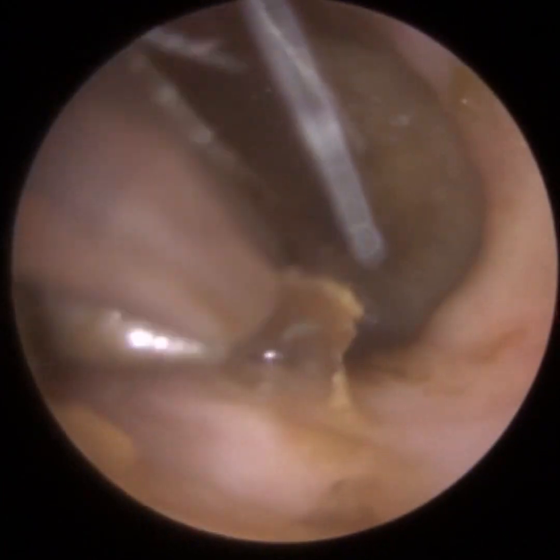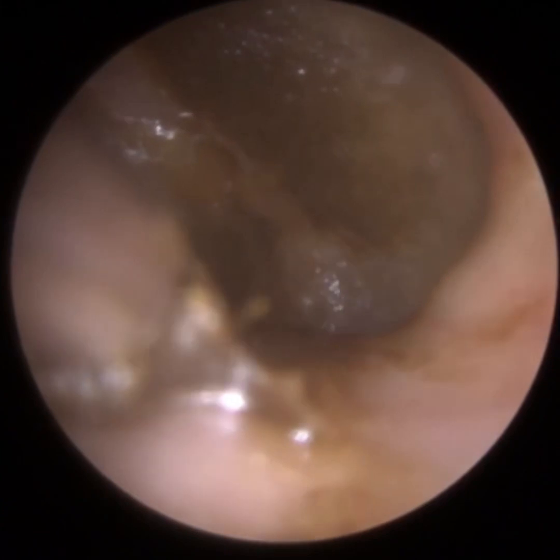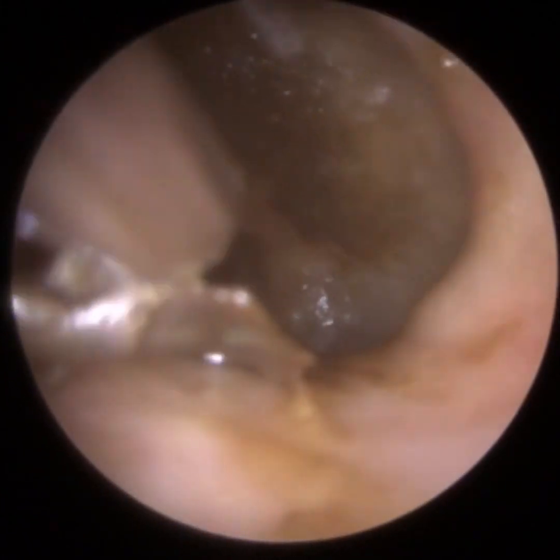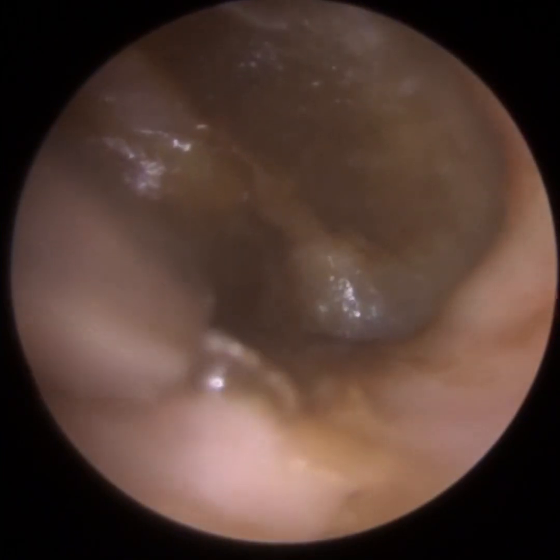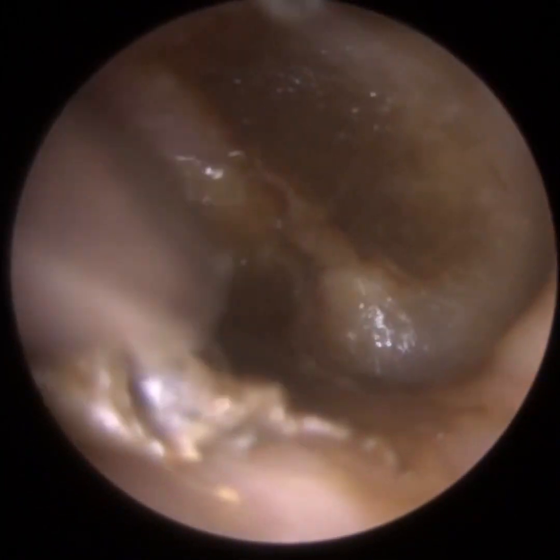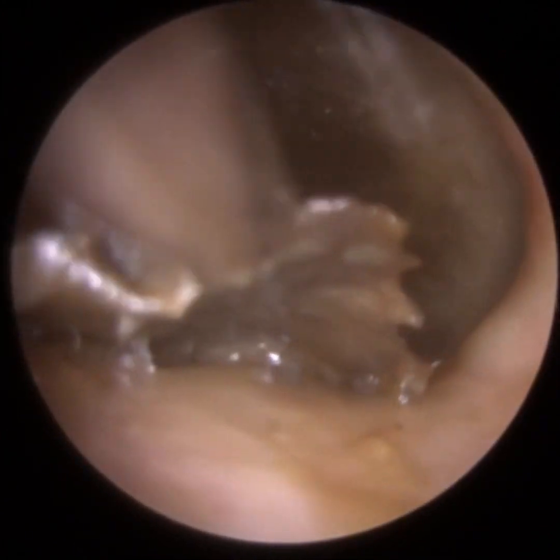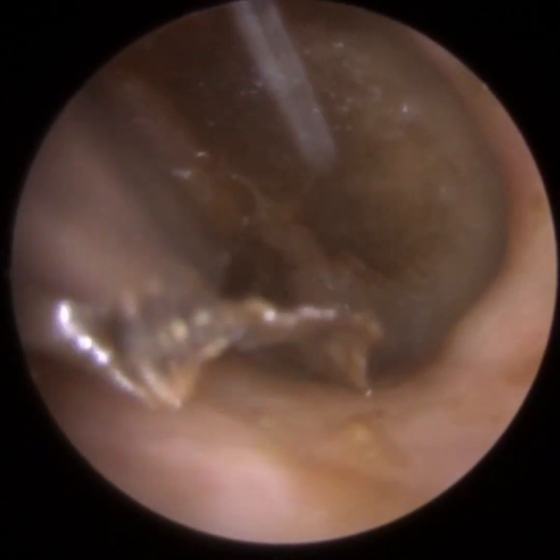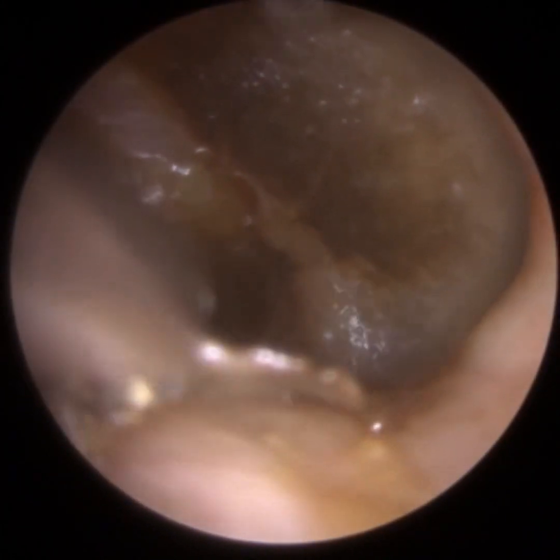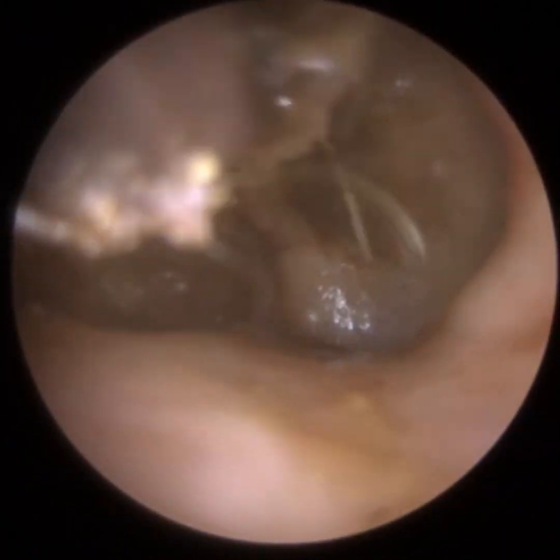We've removed the posterior layer of dead skin. We're now on the anterior canal wall, and in a moment you'll see me approach the eardrum very delicately to remove the skin off it. Because the patient has a slight ear infection the skin is slightly infected, and there's a lot of humidity in the ear. You may have noticed when I insert the iClearScope endoscope into the ear, at first there's a bit of condensation — a bit of fogging — however that dissipates almost immediately after I put the suction probe in.